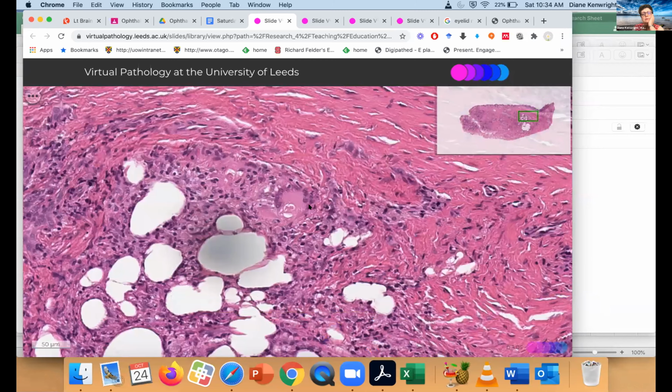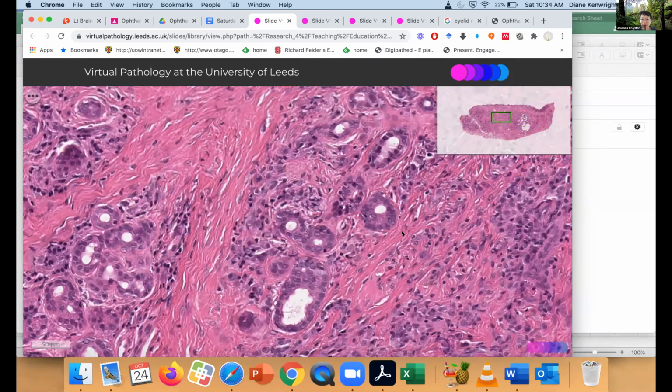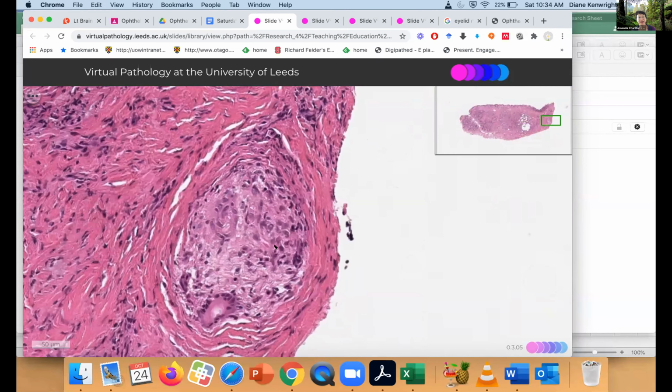Have you got any other tips along those lines, Amanda? I think the giant globs of fat tell me that I can see a lipogranulomatous reaction. This is exactly what it is. And I thought there was a really good nodule. This one's a bit confusing. Up towards the margin, towards the other side. Those two. Yeah, that one there. That's quite a good little example. It is. This is a really great granuloma.